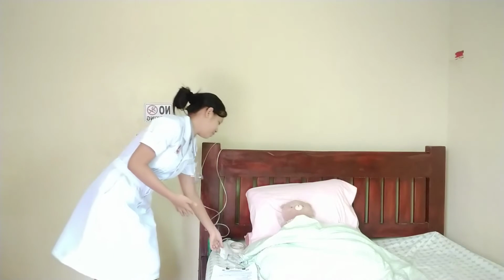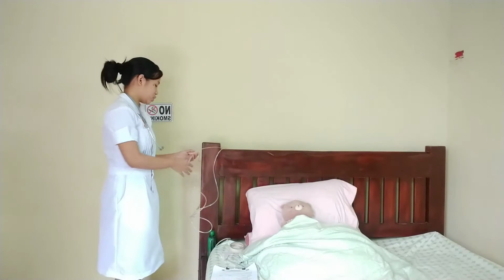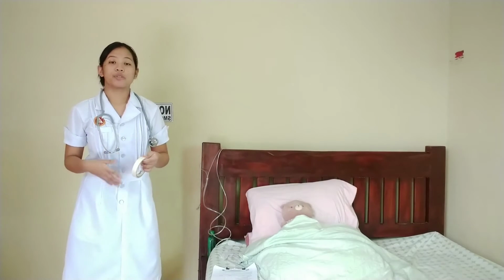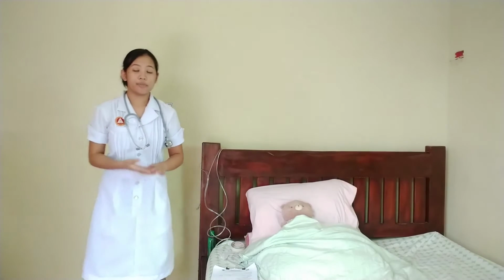Also, I will have the nasal cannula and the tubing, and also a tape. It is optional, so you can use it if the nasal cannula and the tubing don't stay on the client's nares. And then after that, I will now proceed to the implementation.